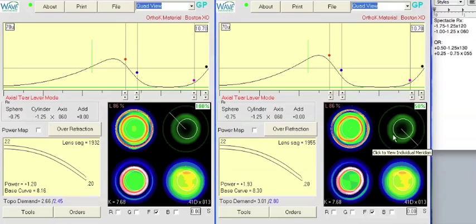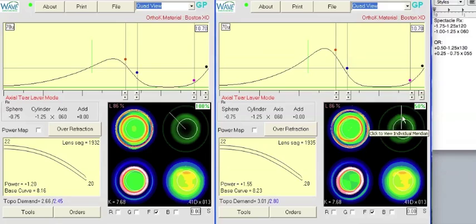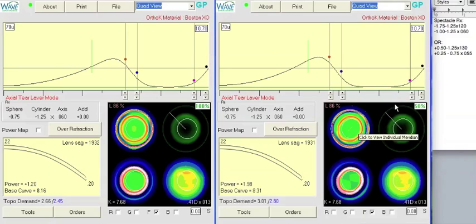Now, all this sounds in theory pretty good, but one of the struggles I think we're going to face is how do we keep this lens in that perfect orientation so that this meridian always is in this meridian on the eye. And I think with a corneal toricity of only slightly less than half a diopter, there's very little mechanical force to keep this lens in place. In other words, it may very well rotate quite freely, and we're going to be inducing cylinder not only in this meridian, but perhaps in many other meridians on different days, depending on how the patient puts the lens on.